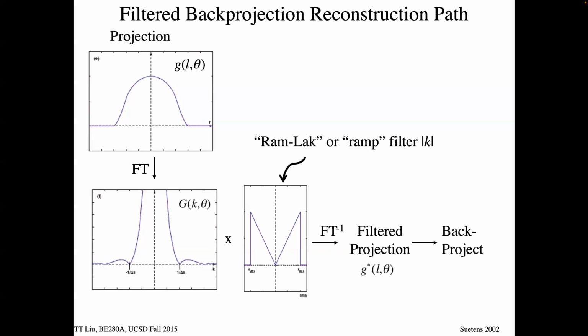But anyway, that thing has an absolutely perfect known image. You can just write down the equation of that image. To get that back, you need to do this. So the weighting that you would get from doing that cutoff is less of an issue. You can deal with the ringing if you set the whole thing up absolutely perfectly in the discrete space.